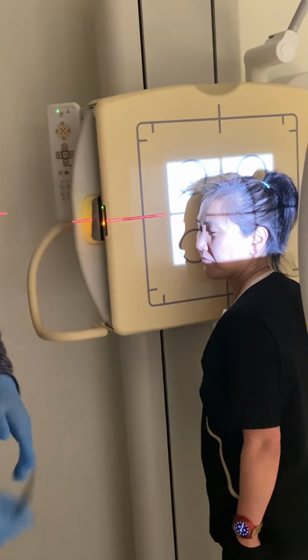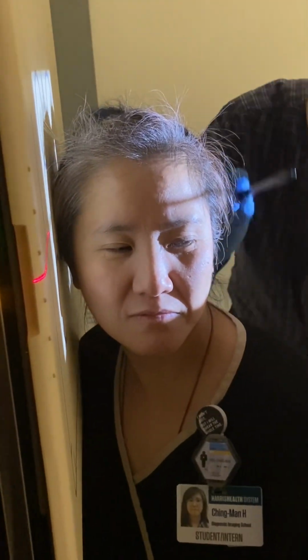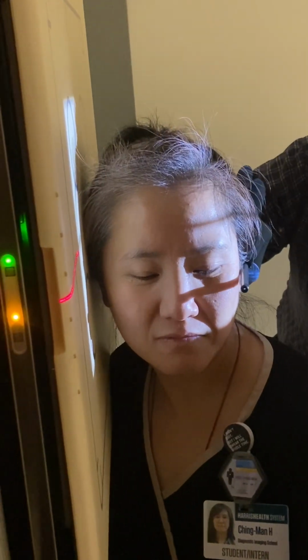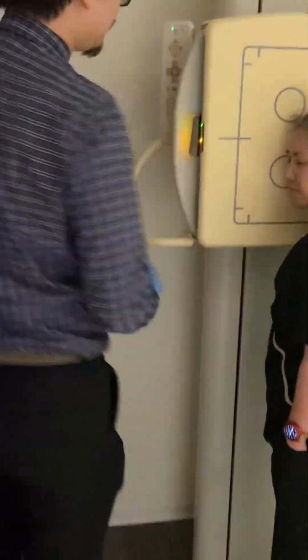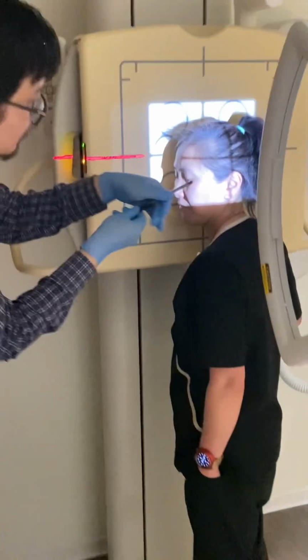All right. So if you come over right now, before she moves, let's take a look. Are we good? Yeah. Almost there. Chin down just a tiny bit. Tiny bit. Good. And that is our lateral positioning. Right, so no tilt, no rotation, and then OID.